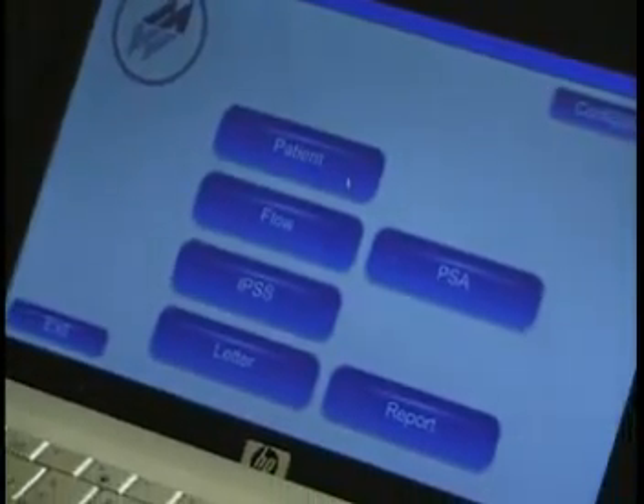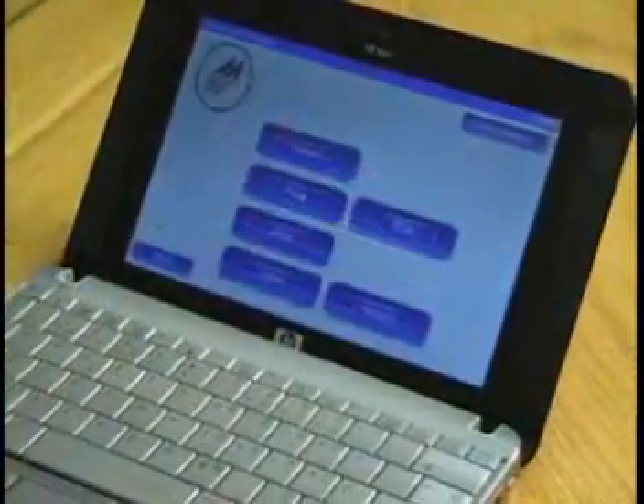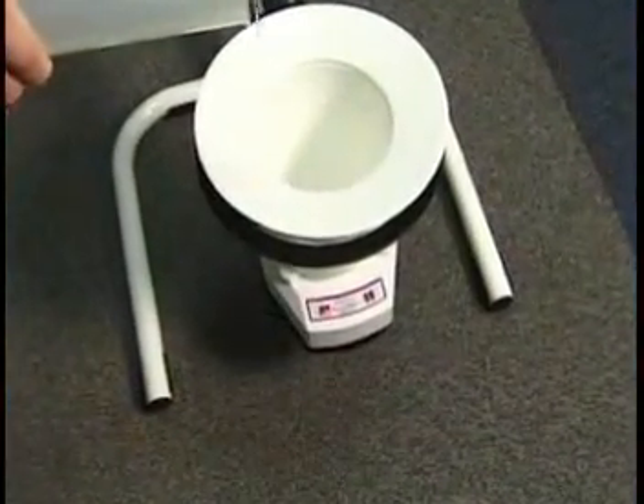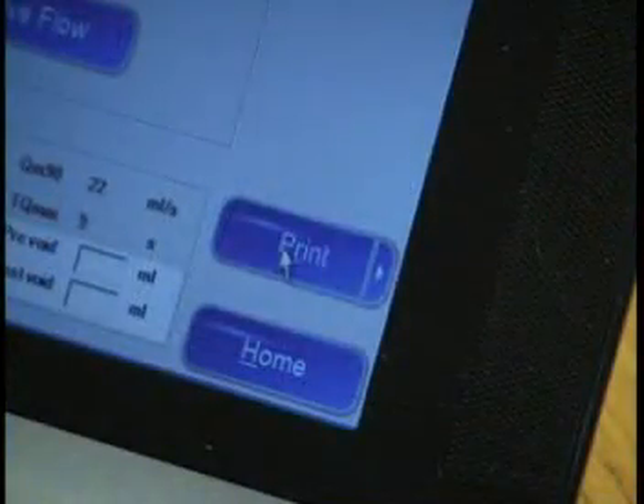Portaflow Advanced is easy to set up and use. Simply start the application program on the PC, and then by placing the funnel on the wireless weight cell flow meter, the Bluetooth connection is established and the system is ready to use. After recording flow for 20 seconds, Portaflow Advanced stops automatically. Click Print to get a report printed out.